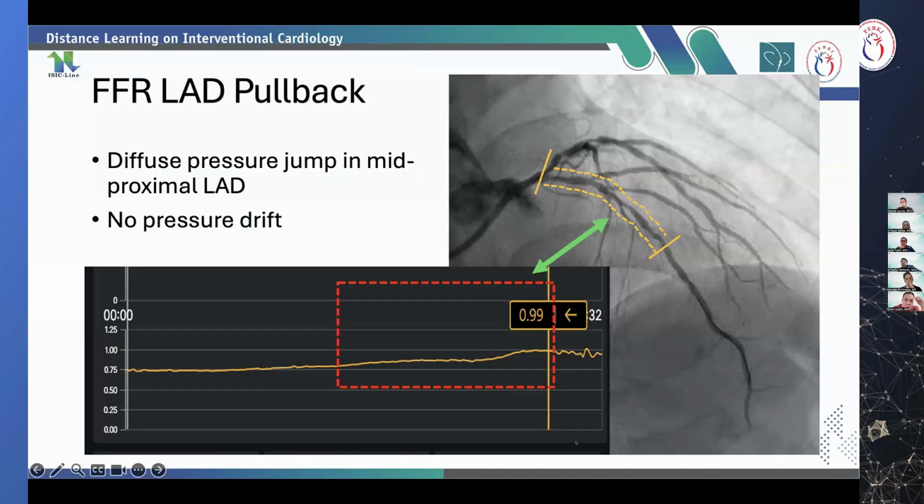Yeah. So why we think about intervention only in the left main, but distally there is a problem of potential shifting that could compromise the diagonal one, diagonal two. So we only do ballooning and then DCB only in the mid LAD. Just a bifurcation procedure only in the left main. So just putting a short stent in the left main to proximal LAD. You think that?